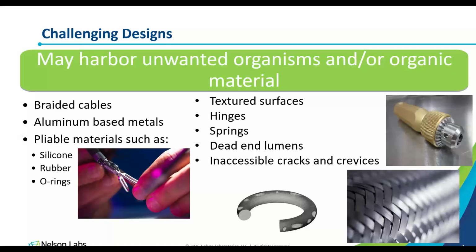And those are going to be your types of water that will then be used to rinse and prepare your detergents and rinse the devices during the cleaning process within the hospital. So it is not an applicable endpoint for reusable devices, but it should still be monitored by the hospital in order to meet those requirements in ST-108.